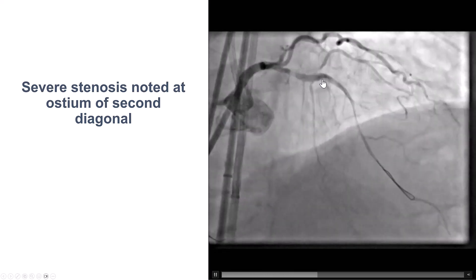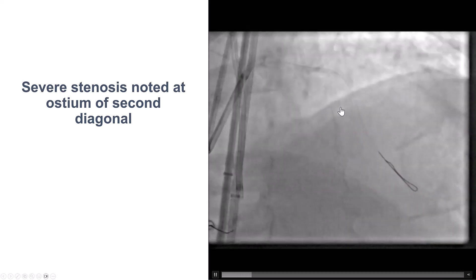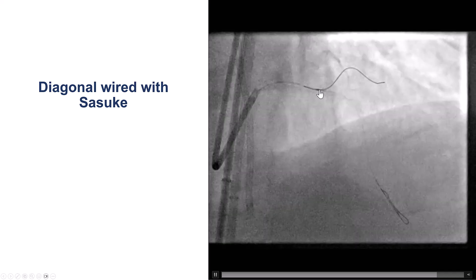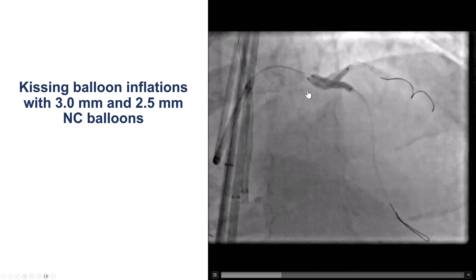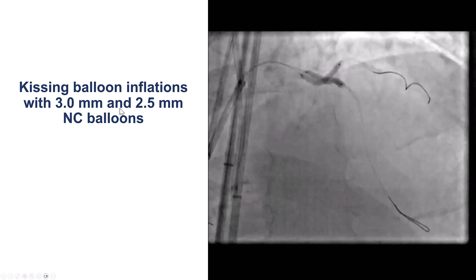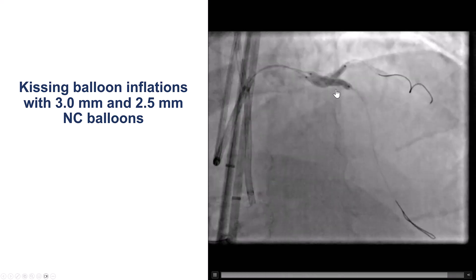On the coronary angiogram, we observe a significant narrowing at the origin of the second diagonal, so we decided to wire it. We used the Sasuke dual lumen microcatheter with a two-operator technique in which one operator on the back probes and the one in front moves the microcatheter. We were able to advance a workhorse guidewire into the diagonal branch. We then decided to do a kissing balloon inflation, using a 2.5 mm balloon in the diagonal and a 3.0 mm balloon into the LAD.